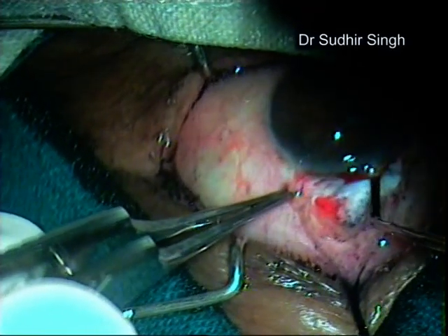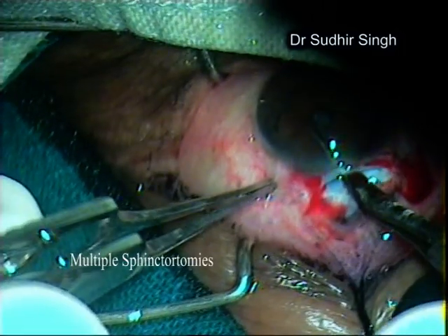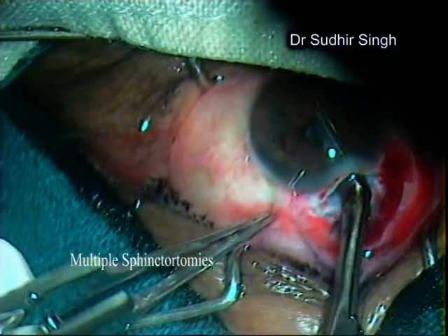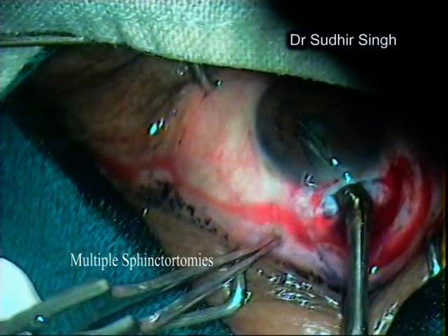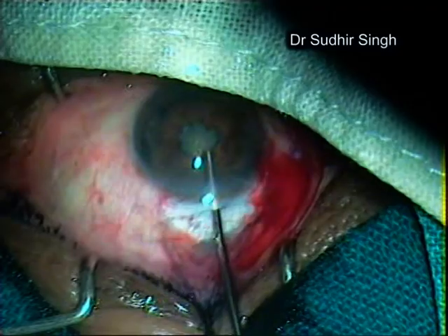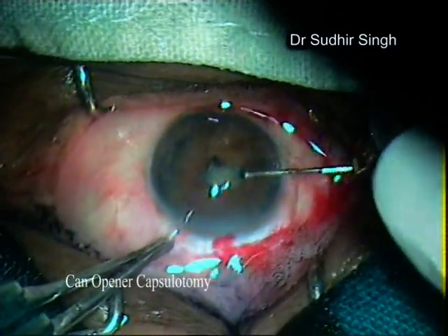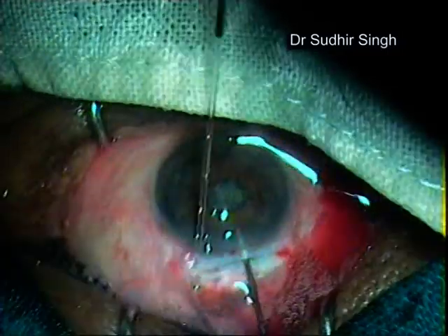This is a post-chronic uveitis complicated cataract. The pupil size is about one millimeter. This is also a very rigid pupil; pupillary stretching was attempted but could not be successful as there are massive irido-capsular adhesions present. So multiple small sphincterotomies are done in the inferior half of the pupillary margin. The lens capsule is stained with trypan blue, and multiple puncture can opener capsulotomy is done.